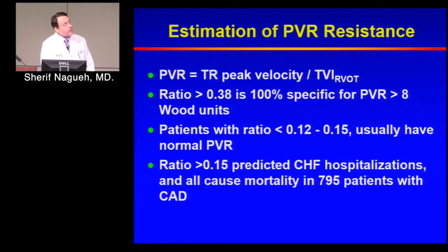Second, the numerator has what we call the transpulmonary gradient, which is the difference between mean PA pressure and wedge pressure. That approach does not have an estimate for LAP. So based on its simplicity, you would say it doesn't perform well across the board, and yes, it does not perform well across the board.